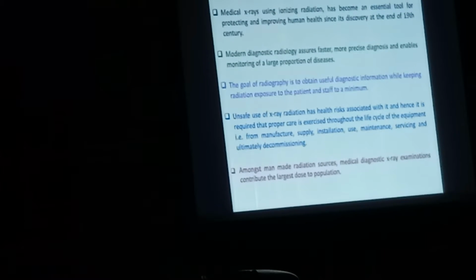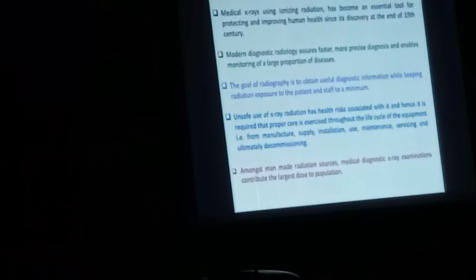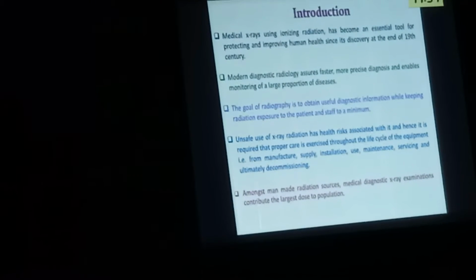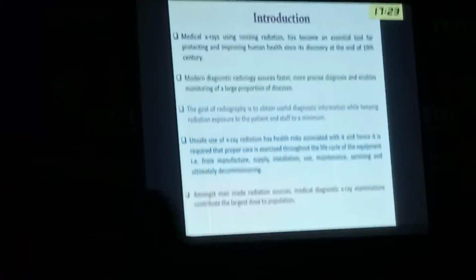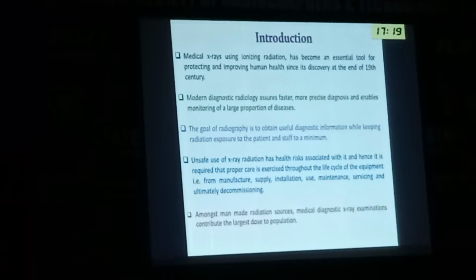As it is ionizing radiation, it can create harmful effects. So great care is to be exercised throughout the life cycle of the equipment, starting from manufacture, supply, installation, use, maintenance, servicing and ultimately decommissioning. Amongst man-made radiation sources, medical diagnostic X-ray contributes the maximum amount of dose.